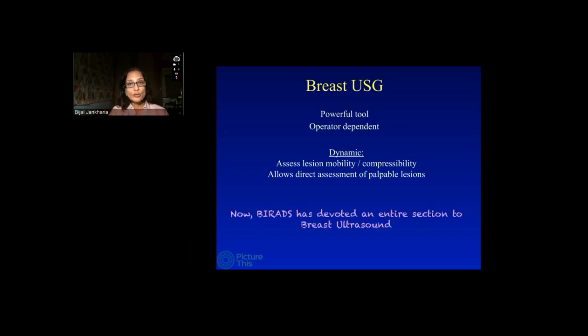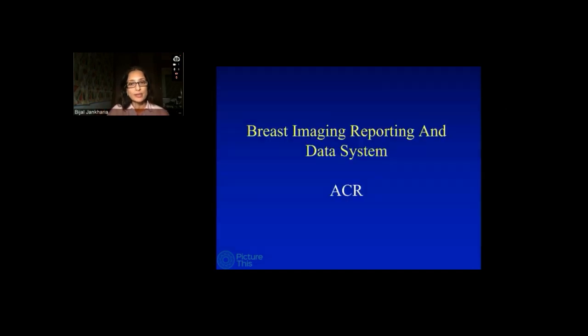It is so useful that now BI-RADS has devoted an entire section to breast ultrasound. And I keep getting asked this: we did only an ultrasound, we've not done a mammo. Can we still give a BI-RADS category? Of course you can. And we'll be talking more about it throughout this talk.